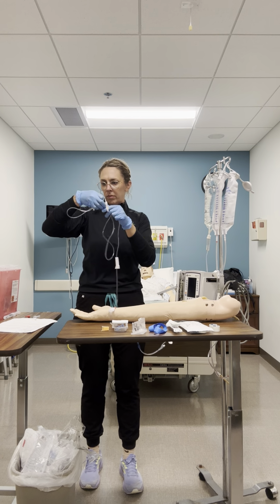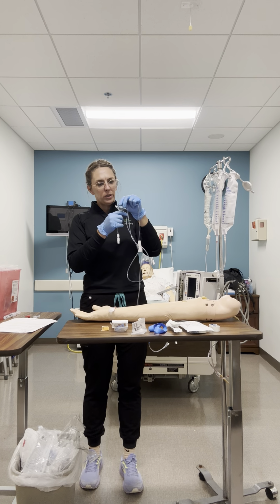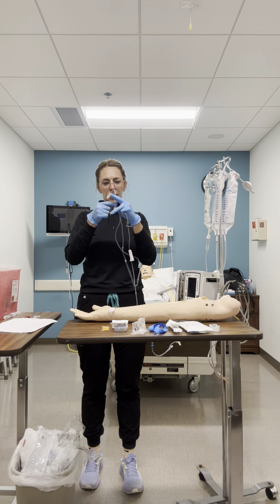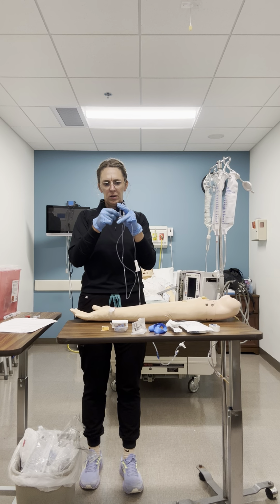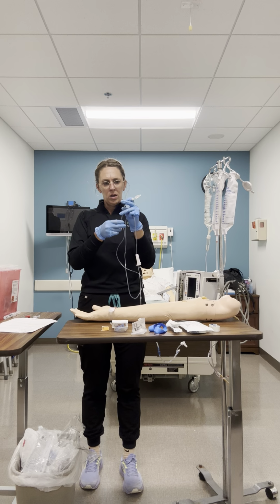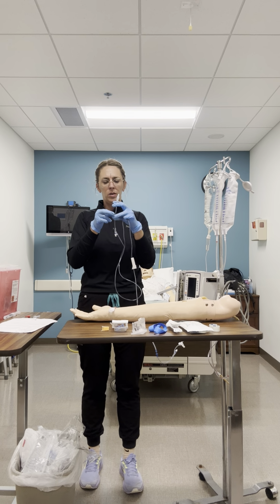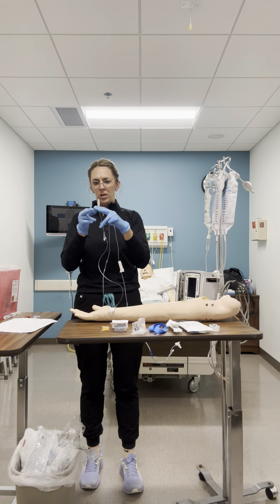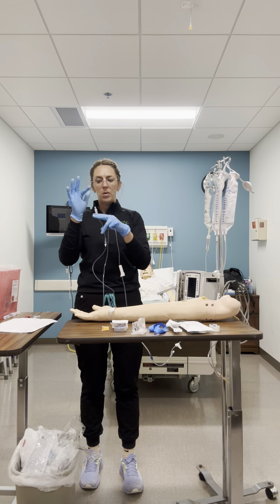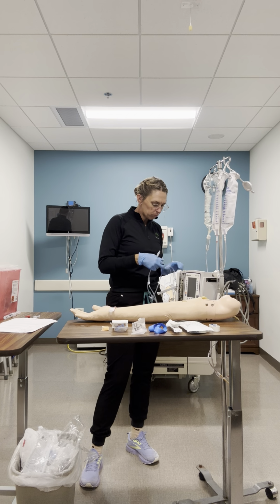Gonna invert my port. There's a little bubble in there, so I'm gonna get my bubbles coming up to the top so that they're released. Wonderful. And I'm going to make sure that the lid is on my IV tubing, which it is.